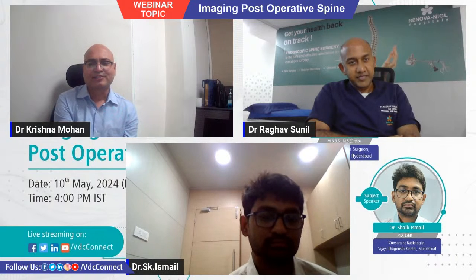With this short introduction, I just want to open up the discussion with Dr. Raghav first. Raghav, what are your expectations from us? After surgery or after any procedure, if the patient again comes with pain, how do you want to plan, what do you expect, and what do you want us to do?